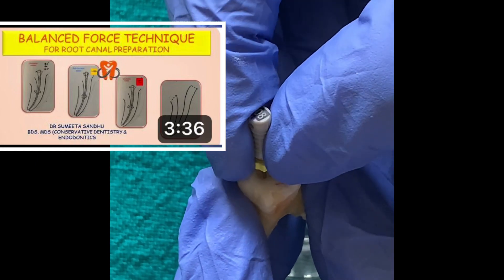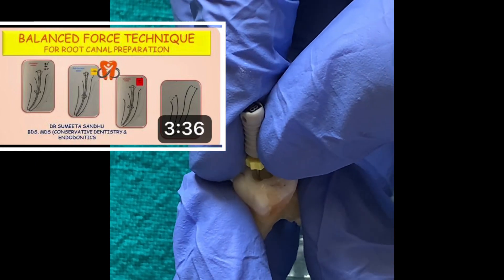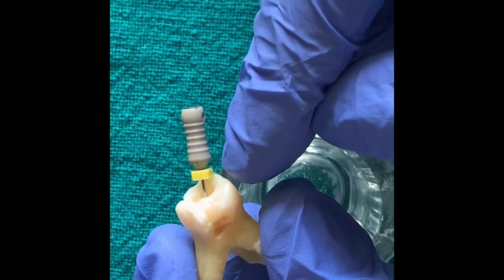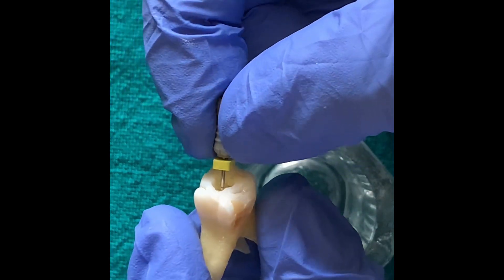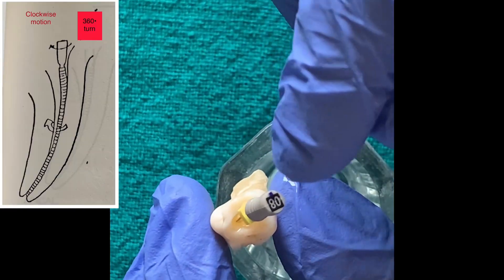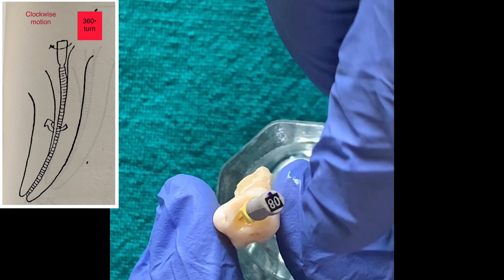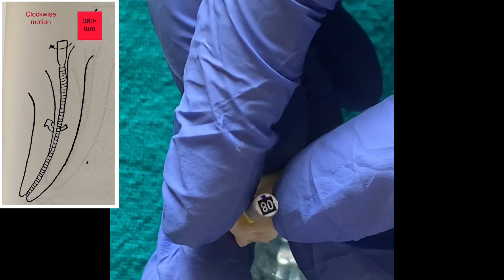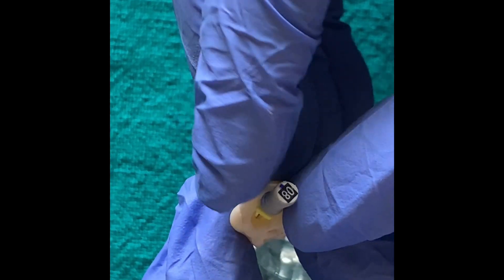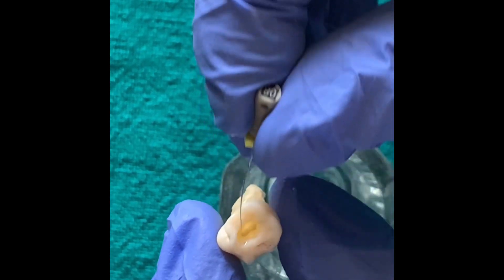I have explained this technique in great detail in my previous video — you can watch it if you have any doubt. Now we have reached the working length. At this point we perform the third type of movement: the instrument is rotated one full turn in a clockwise direction and pulled out. This motion loads the debris onto the flutes of the file and removes them.